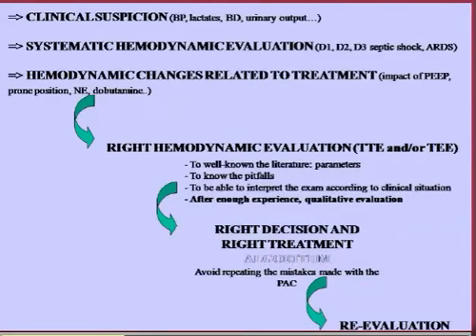And it's very important, I think, that after enough experience, we spoke about that yesterday, you have to be able to give a qualitative evaluation, not to do measurement, because of the variability of measurement or because of the risk of errors. You have much information only by describing what you see on the screen of the machine, but it requires some experience with the device. And finally, you can take the right decision and the right treatment. And I think it's a key point, and Jean-Louis reminded this point.